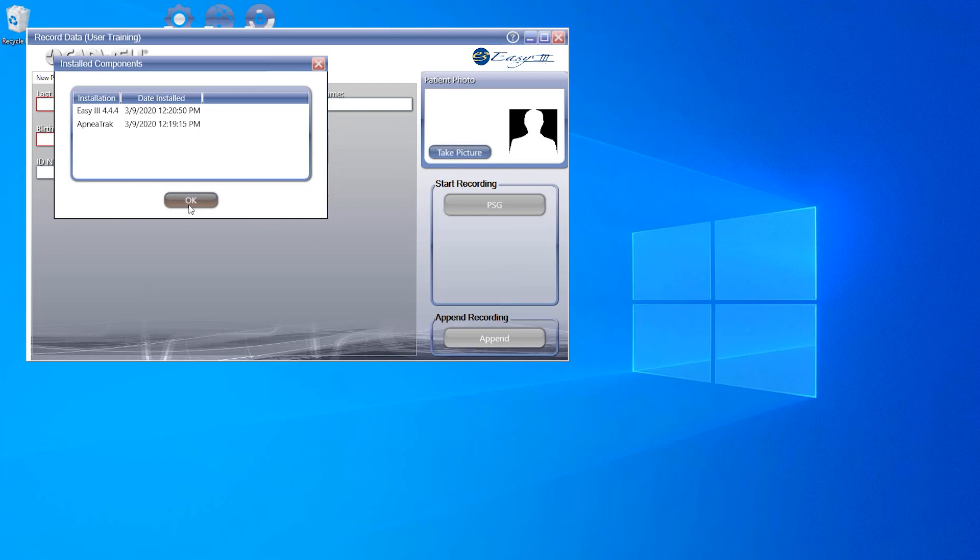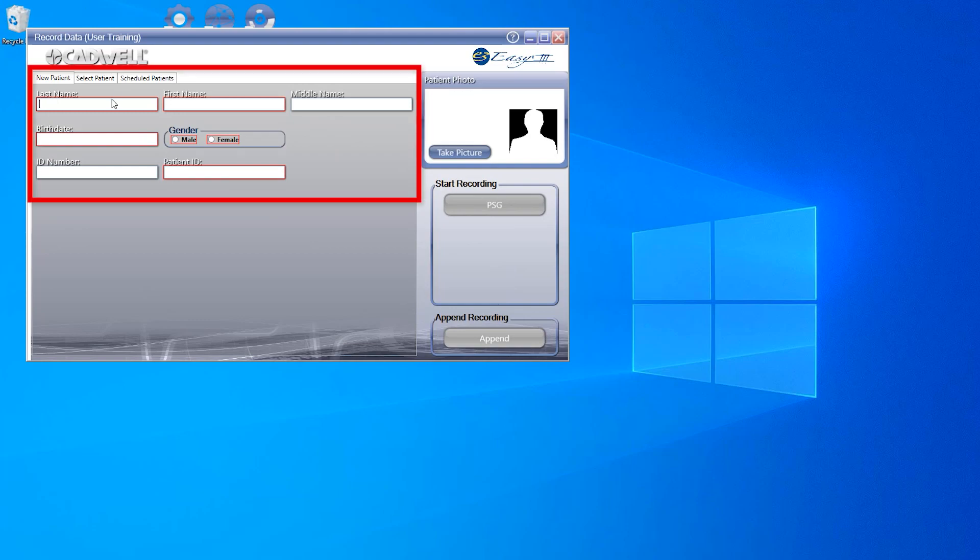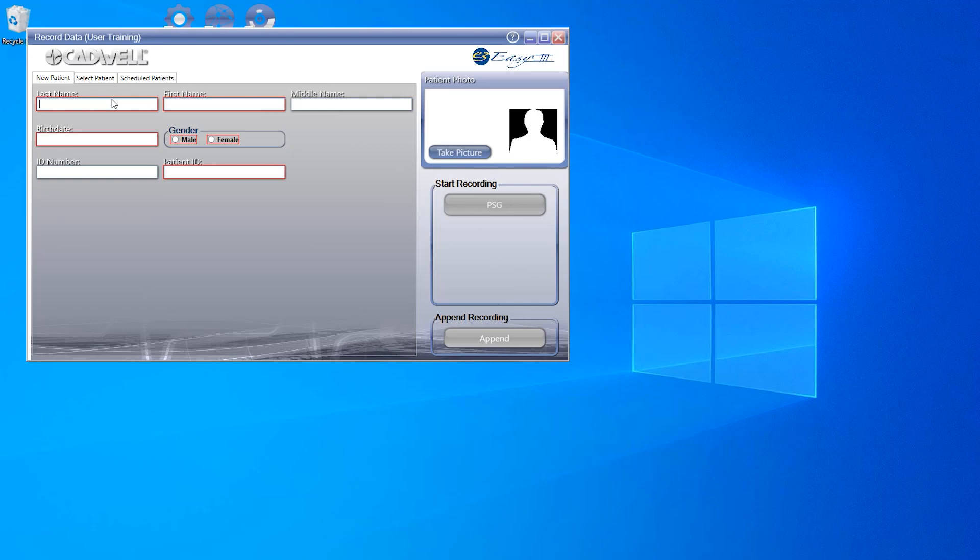If you speak with any of our CADWL support team, they may ask you for this information. Now, to start our recording, we first need to enter our patient information. This can be done using one of the three tabs on our dashboard.